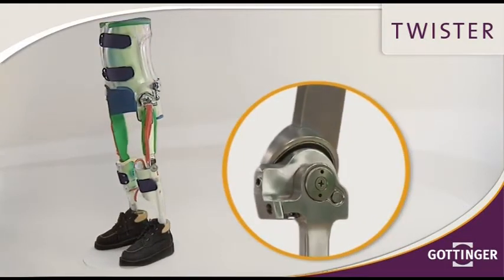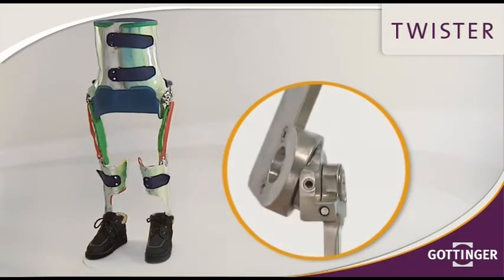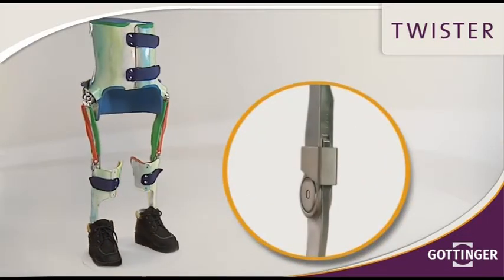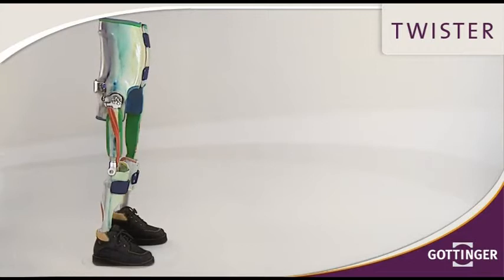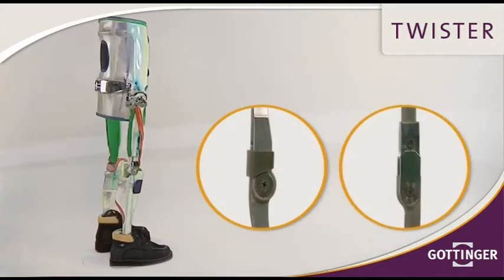The two-axis hip joint has a pre-select function. A little button releases the joint before opening when sitting. This orthosis always comes with a fixed knee joint. The ankle joints are designed with a defined friction and individual plantar and dorsal stops.